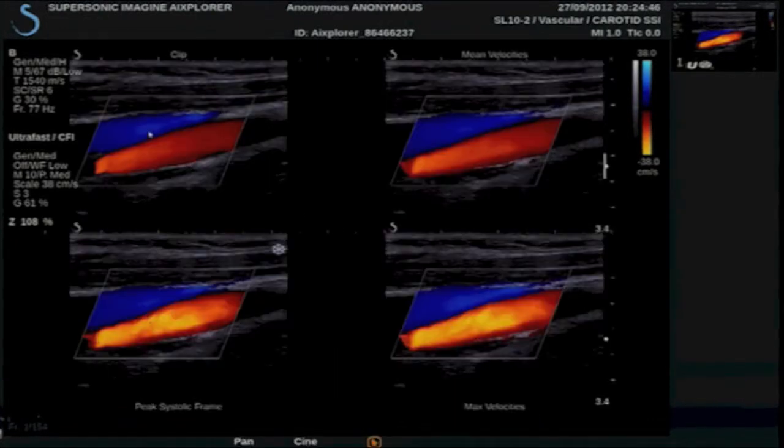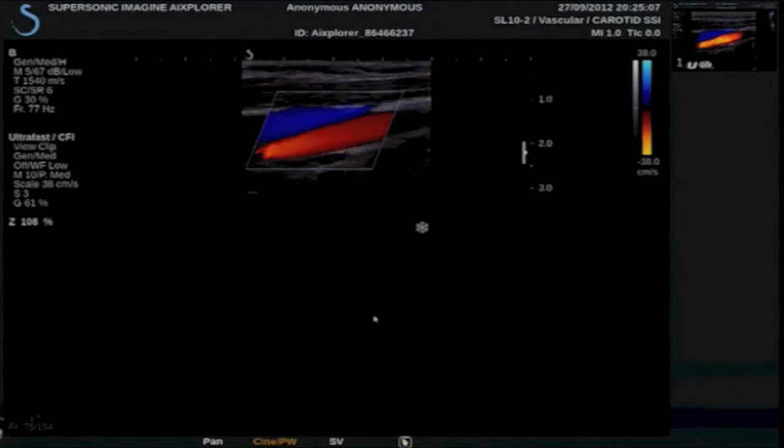The first view is the clip, which we can play. Below it is the peak systolic frame, and we have the mean velocity and the max velocity over the cardiac cycle. I am going to select the peak systolic frame, go back to my main screen, and display the peak systolic frame.